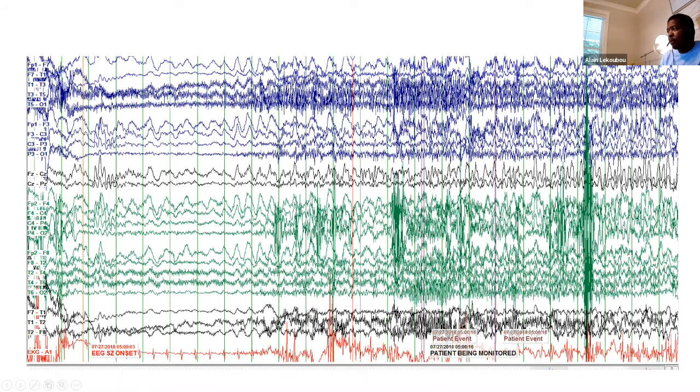Is it coming from the temporal lobe, this is the temporal lobe here, or is it coming from more in the central region? It's still not clear. Maybe temporal up here. We don't know. So you see, my EEG was good to capture the seizure, but it wasn't able to tell me exactly where things were coming from. Despite all my efforts, I put like 20 electrodes, and still I don't have enough information. And then I say, okay, let's go in and see if we can get more seizures. That's why we did a stereo EEG implantation.